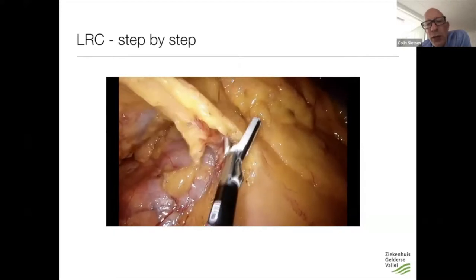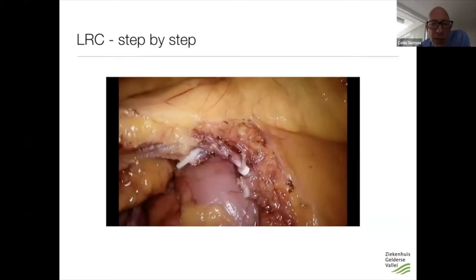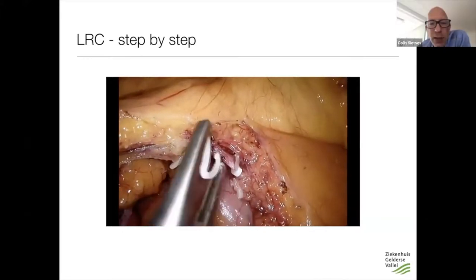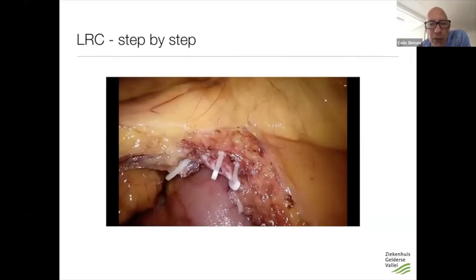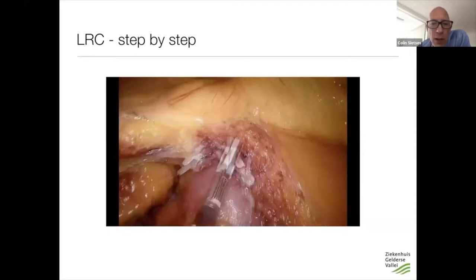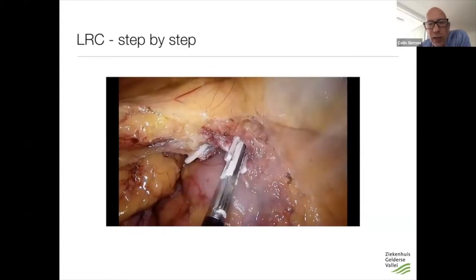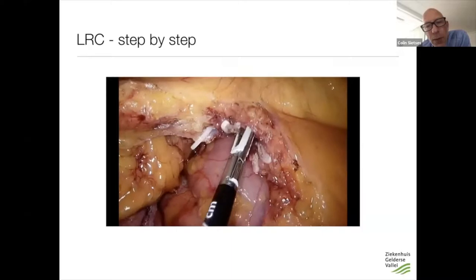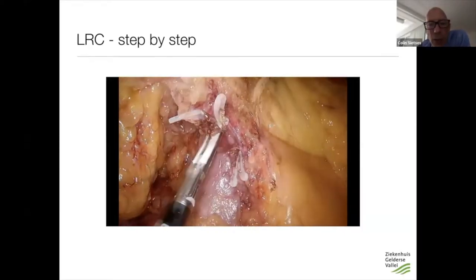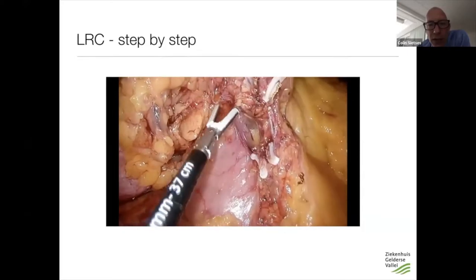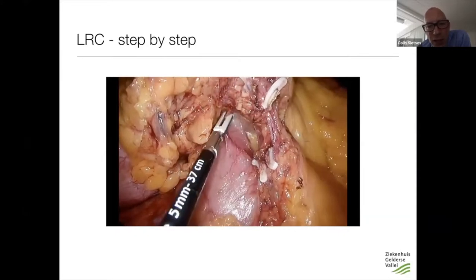This is specifically a D2 dissection, not D3. This is what we standardly do in the Netherlands. I'm aware that in German-speaking countries D3 is more commonly performed, but in the Netherlands D2 is the standard. So you clip the artery and vein, then open up the fascia of Fredet — this is an essential step. You open it; it's not a big fascia, more like a peritoneal structure, and you free it.